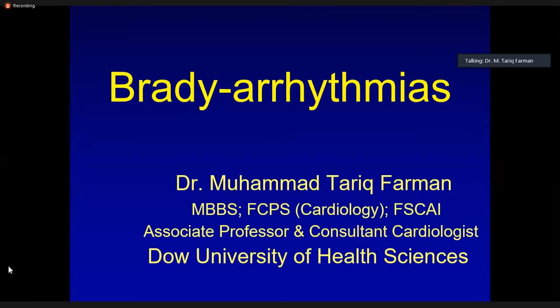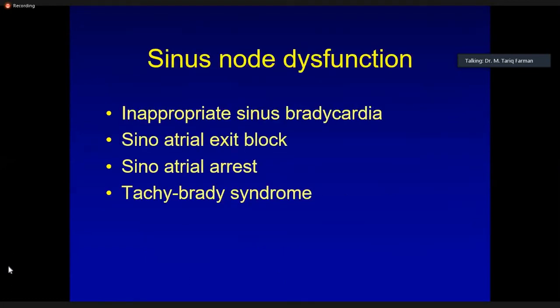then it is okay. If anything disrupts this electrical traveling or electrical activity of the heart from the SA node to the atria and at the AV nodal level, it causes arrhythmia. So we have two types of arrhythmias: bradyarrhythmias and tachyarrhythmias. Now, first of all, we are going to discuss bradyarrhythmias.